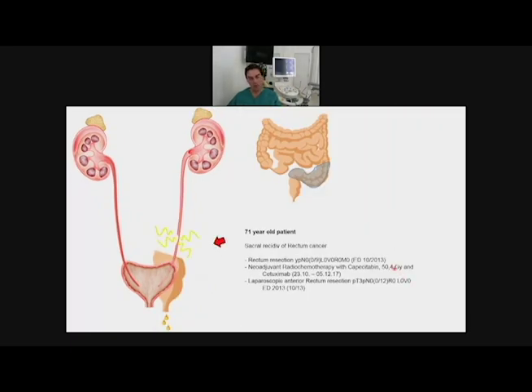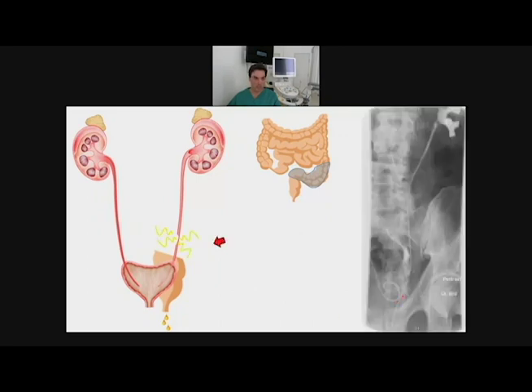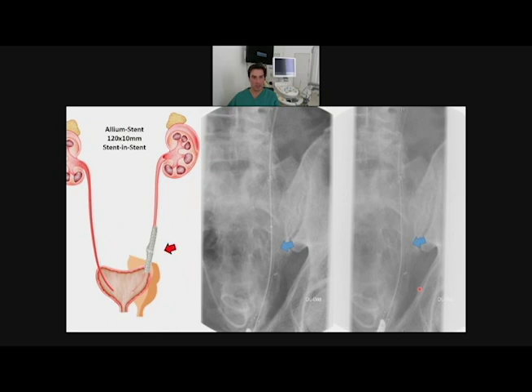I say new is, and this is the important part, that we can use it also for ureteric bridging. A typical case is, for example, after rectum cancer surgery and radiotherapy, where a big part of the ureter is destroyed and fixed. It is not a good idea after such treatments to make an ileum interposition or a reconstruction with a Boari or psoas hitch, because the blood supply is also poor, so it is not a good idea. What we do now, if you have a total leakage with a destroyed part, is bring a bridging inside. We put a stent totally across the part where it's damaged, and you see it straight on the picture.